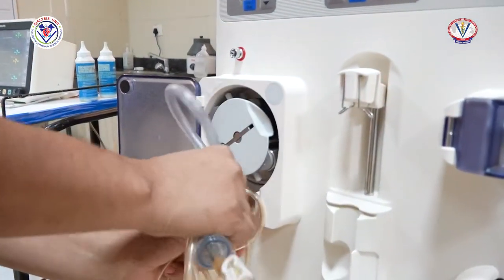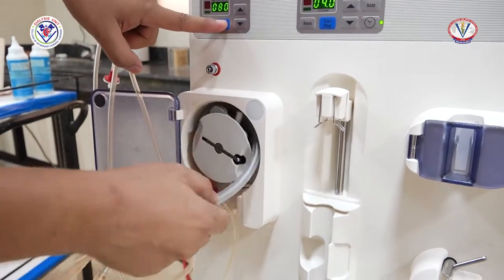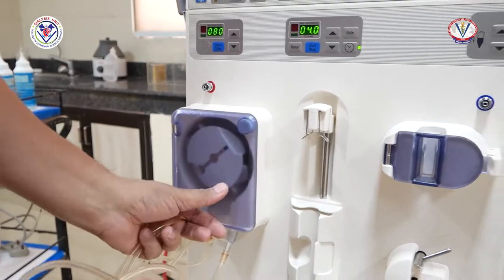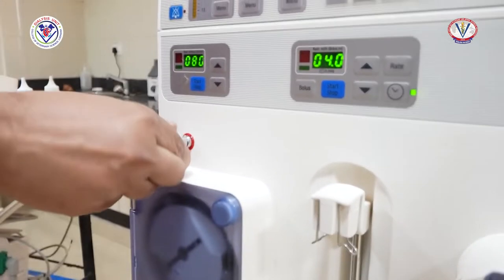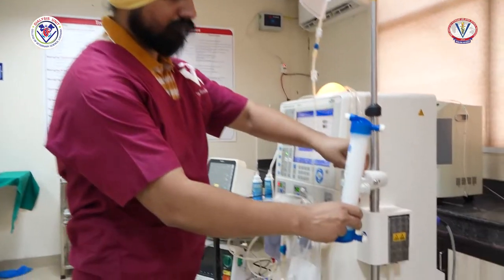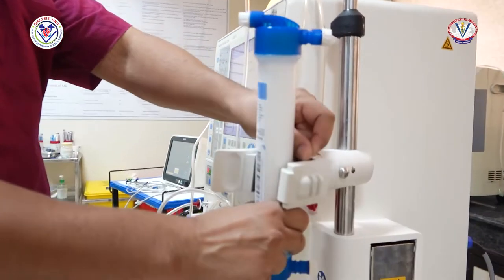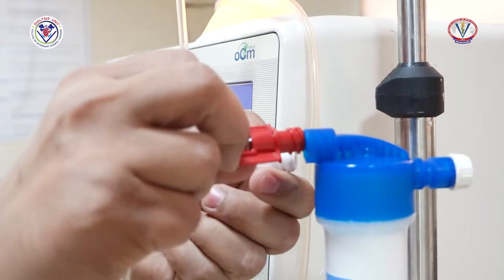First, take the arterial line and attach the blood pump portion of the arterial line to the blood pump. After that, fix the arterial pressure port of the arterial line to the designated port of the machine. Now, place the dialyzer in the dialyzer holding clamp and connect the arterial port with the dialyzer.